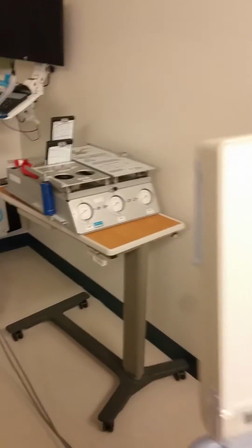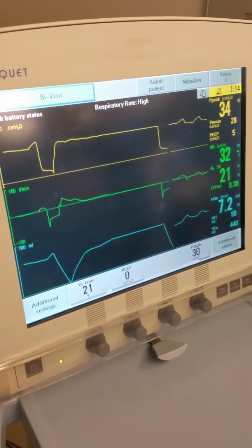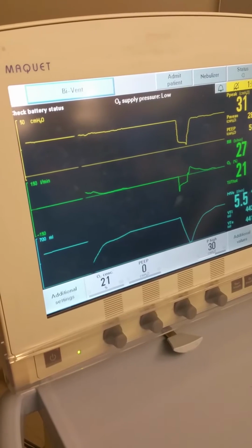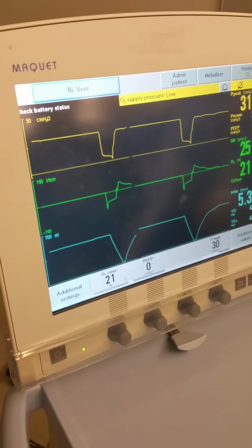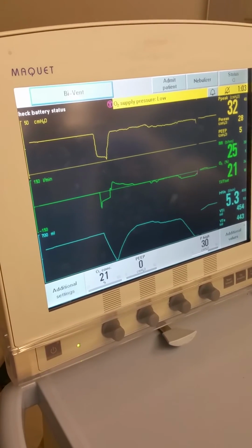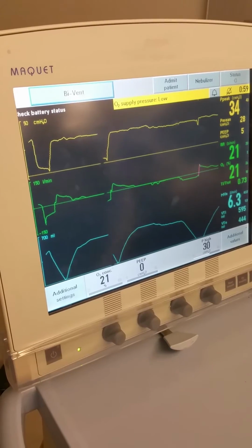Yeah, essentially, but the whole purpose of this is to maximize your deflation as well. So usually we're not going to set it even as a backup. We're just going to leave it at 0. But yeah, I see your point. You're saying as a kind of baseline so it doesn't get past that. But it's constantly evolving. Yeah, yeah.